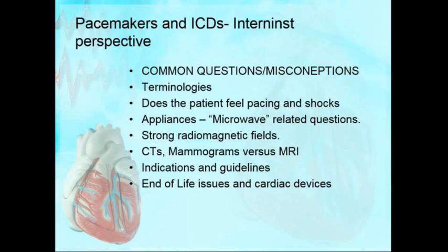However, in a selected few patients, they can actually know that they're getting paced. And just for teaching purposes, if somebody had a pacemaker put in the day before, and the patient is admitted to your service, and the next morning the patient says, Doc, I'm feeling the pacing, there are a few things you should think. Again, you probably still call the cardiologist and take care of this, but if you're a hospitalist in that situation, what are the couple of things you should think if you put a pacemaker and the next morning he's actually feeling it? I feel the pacemaker thing. What if the patient says, I'm feeling hiccups?